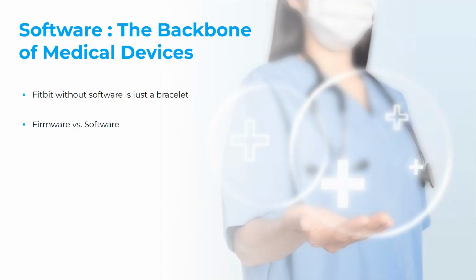And as far as firmware versus software, a lot of things will get to the hospital, and like I said, they will have a controller or something software-based that is going to operate the machine or help use the machine. But the machine itself is still doing the bulk of the diagnosis or the bulk of the work.